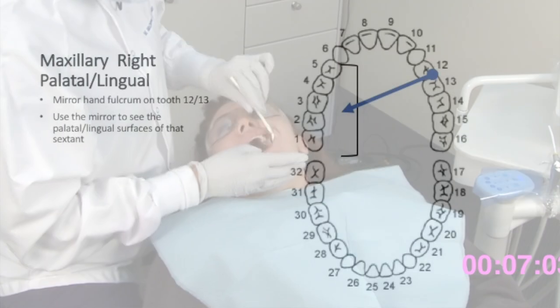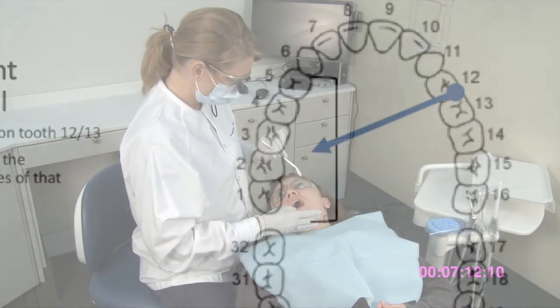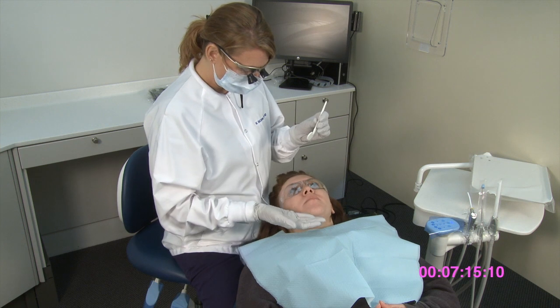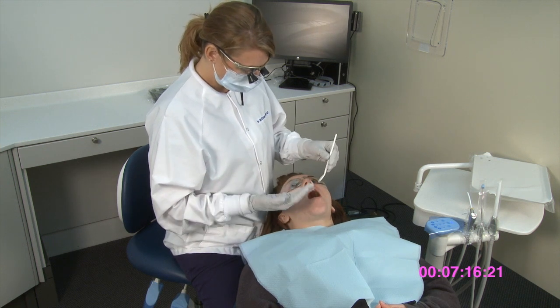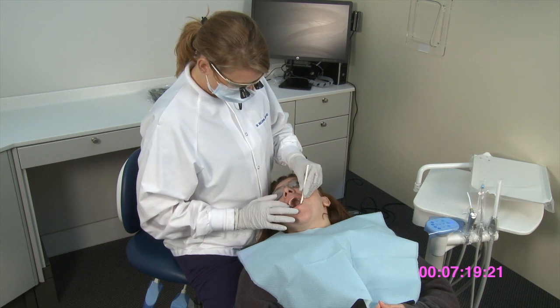Maxillary right lingual. The mirror fulcrum will be on the premolars of the left. Use the mirror to see the lingual surfaces. The patient's head is towards you and the chin is up. The clinician will sit between the 10:30 and 11:30 position.